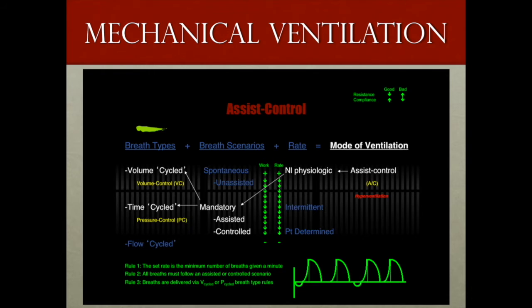In assisted ventilation, you will have better synchrony because the patient will be triggering each breath with a negative inspiratory trigger. However, if the patient becomes apneic, they will not trigger the breath and they will not be mechanically ventilated and will be apneic on the vent. By combining both of these aspects and having assist control, you can have the synchrony of assist, but have the backup of control in case the patient goes apneic.